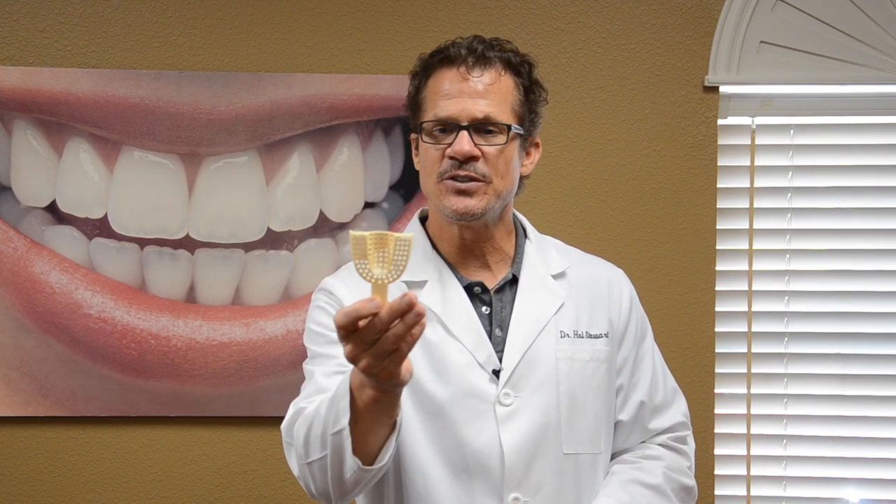Often times when we teach our auxiliary courses and the auxiliaries bring their impression trays that they use in their office, they bring this type of tray — either metal or plastic with perforations in it, as you can see here. The perforations are made to hold the material, so it will ooze out the perforations and then set up, and the material will stay in the tray.